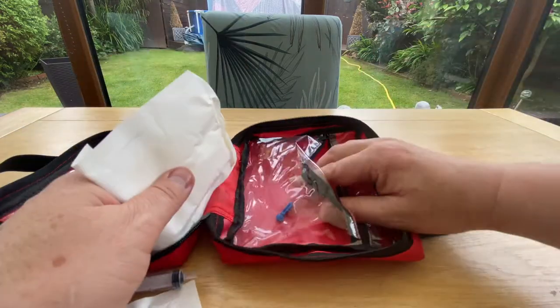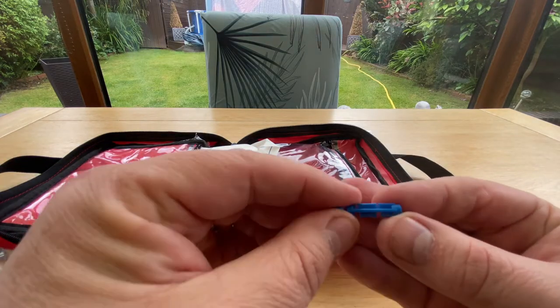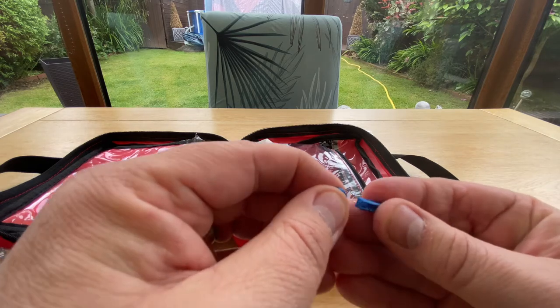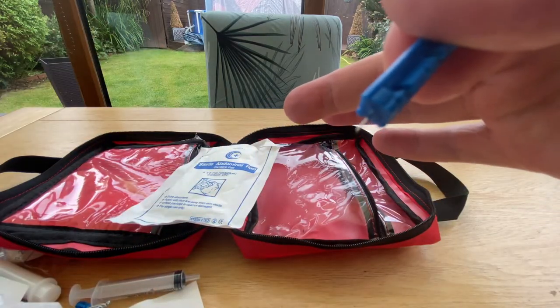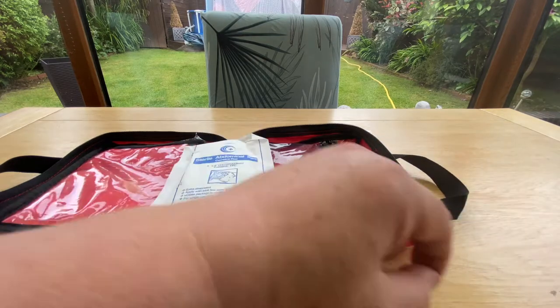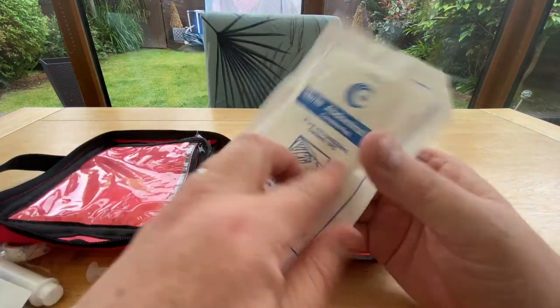There are a couple of small blue items — I wasn't sure what they were at first, but on closer inspection there's a needle inside one of them: it's just a safety holder for a needle. And finally there's a sterile abdominal pad — just the one of those in there. So that's everything out of the kit.